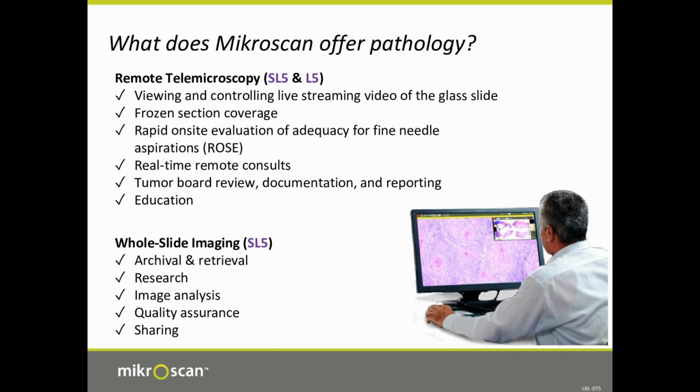They can be over 2 gigabytes in size. So they can be a challenge to upload and to store and to manage long term. So when you're doing live microscopy, another advantage is it gives you immediate access to the slide. So for anything that has urgency associated with it, such as a frozen section or a rapid on-site evaluation, live telemicroscopy is a good choice for those reasons.